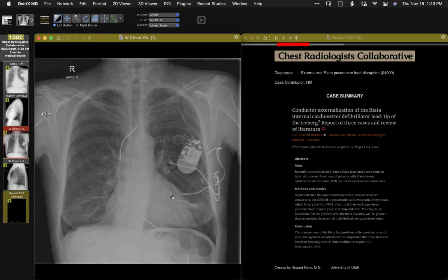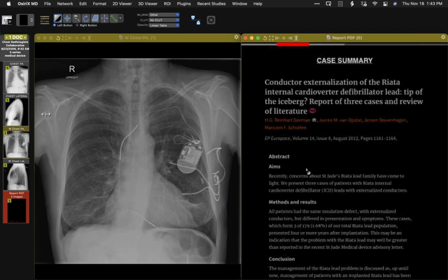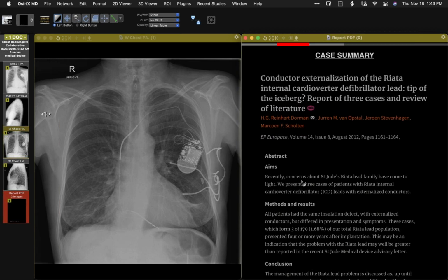So a curiosity. Howard, is that a newer case? Because I remember seeing a couple of these here. When we heard about them, we did some radiographs to evaluate for these, but I haven't seen one in years. And I was just curious if they're still floating around out there, if they've checked them all, or if you're seeing any, or if anyone's seeing any requests to check these.